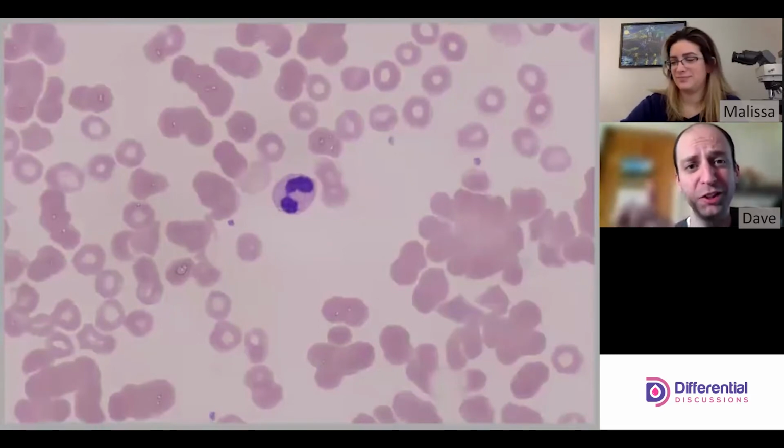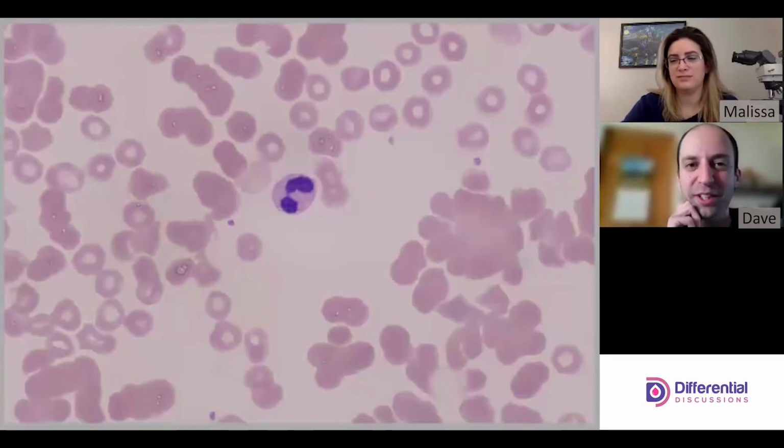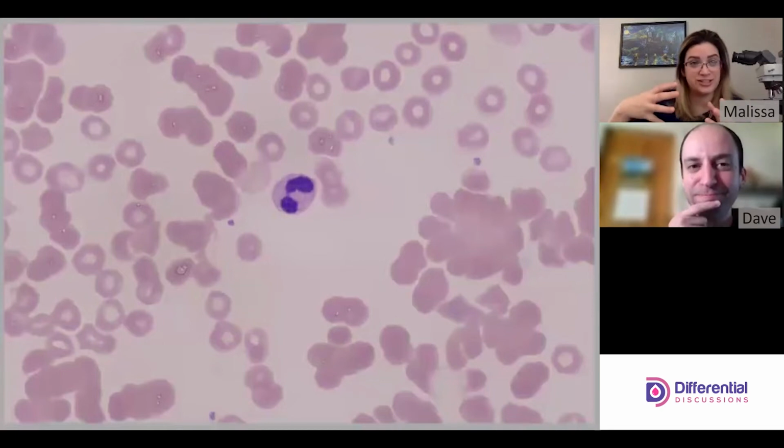Recall those patients, you invert the tube a little bit and you can see it's like a grainy red in the side of the tube. It's actually pretty cool. I have a slide here. You guys can't see it, but when you look at it, you can see the graininess on the slide because it's so agglutinated. We're not looking at that one. We're looking at one that's a little less agglutinated so that we can actually see agglutination versus just a giant clump of red cells.